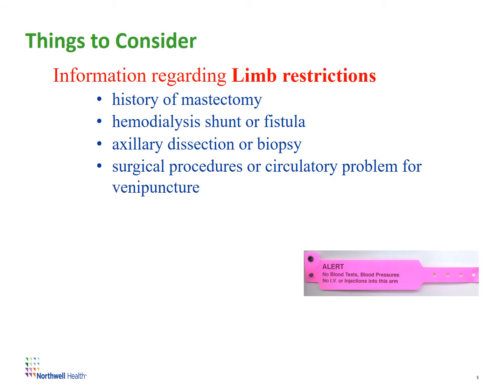Another important factor we have to keep in mind before starting an IV insertion is any limb restrictions for that particular patient.